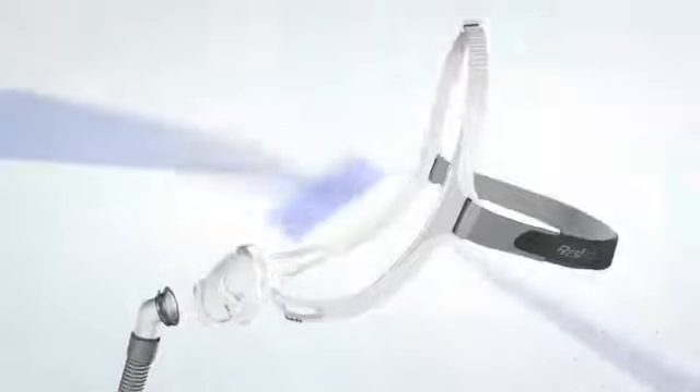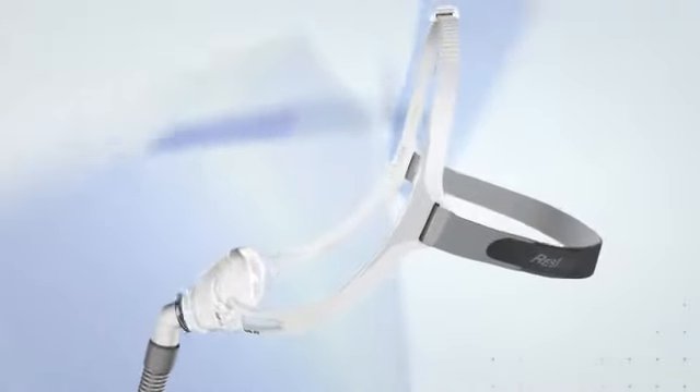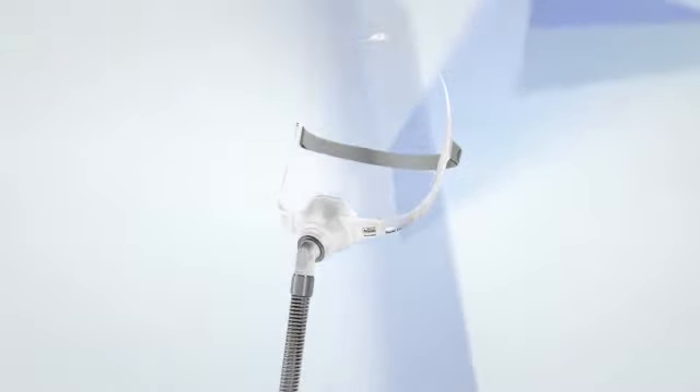Congratulations on purchasing your Swift FX Nano Nasal Mask. It should work just fine all of the time, but here are some tips if you ever encounter a problem.